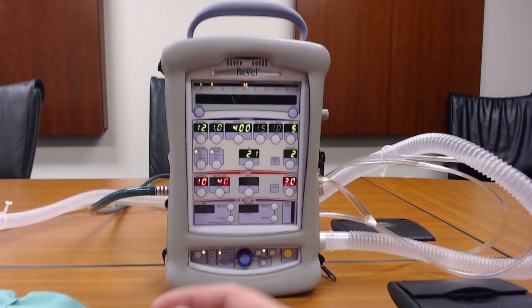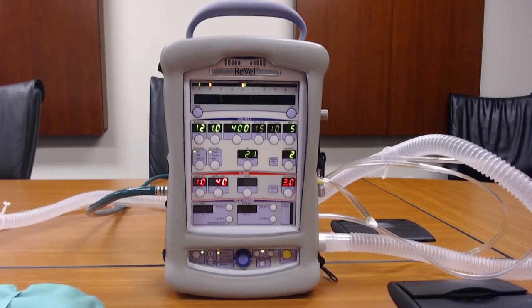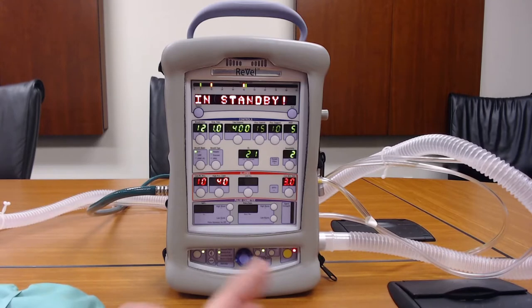Hi, and welcome to another video on the CareFusion ReVel Ventilator. Today we're going to be discussing the use of nebulized medication through the ventilator.